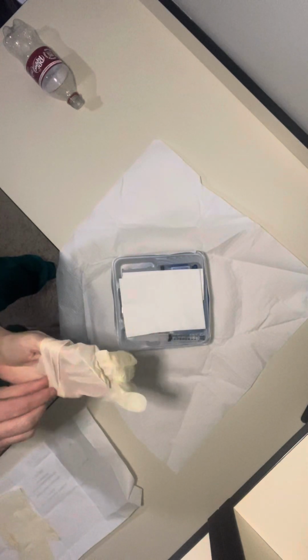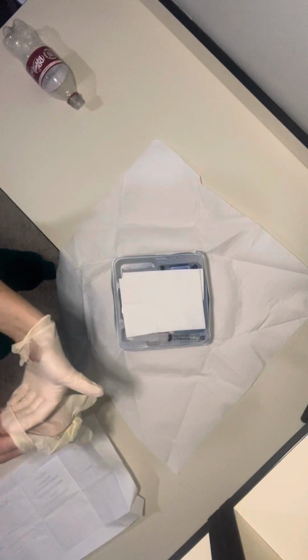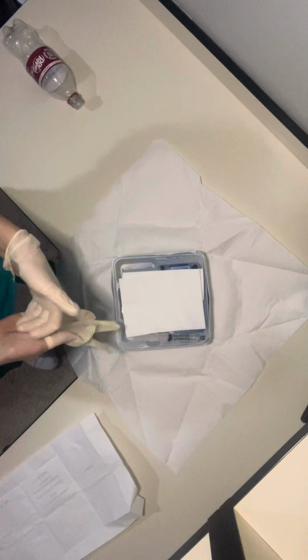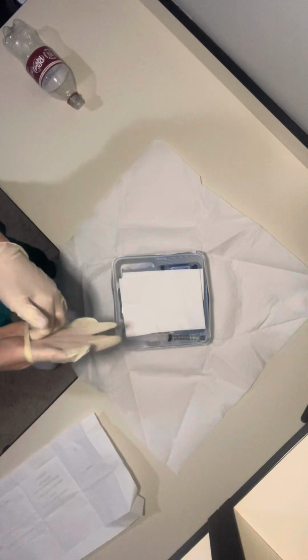I'm gonna try to be gentle because it is torn. Okay, and then I would only touch the inside of the cuff. So if I contaminate, just as I did just now, I would discard and get a new set of gloves. But I would stay only under the cuff. They're just kind of flimsy, but yes.